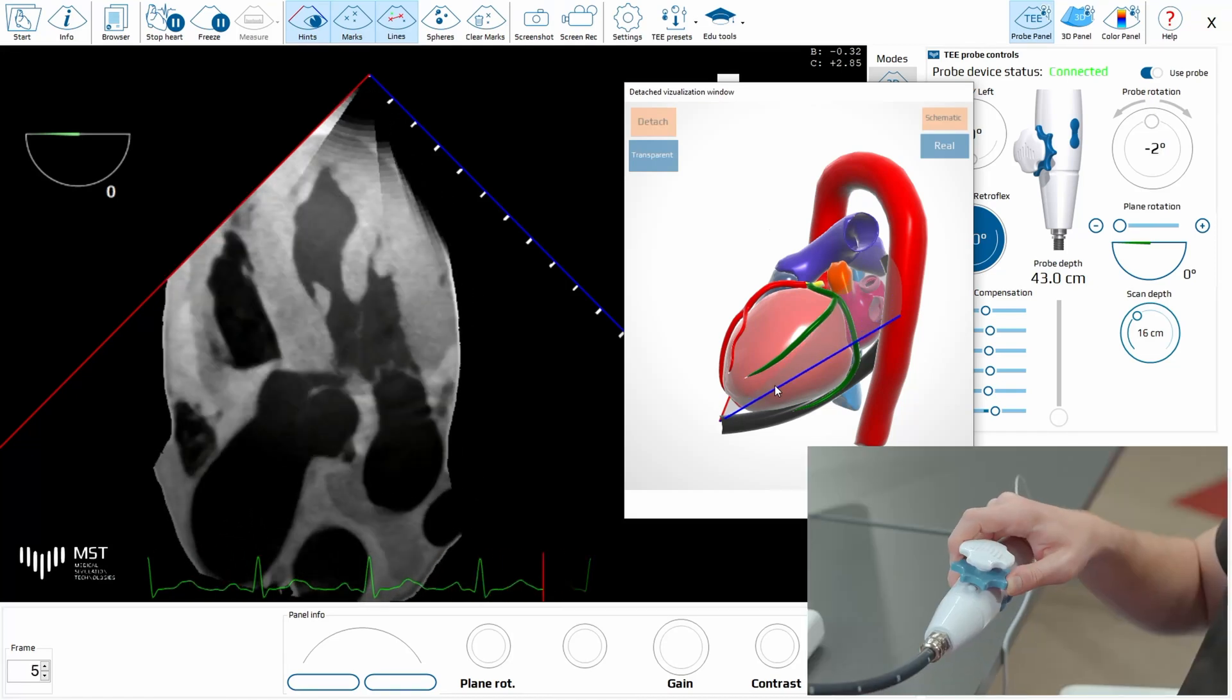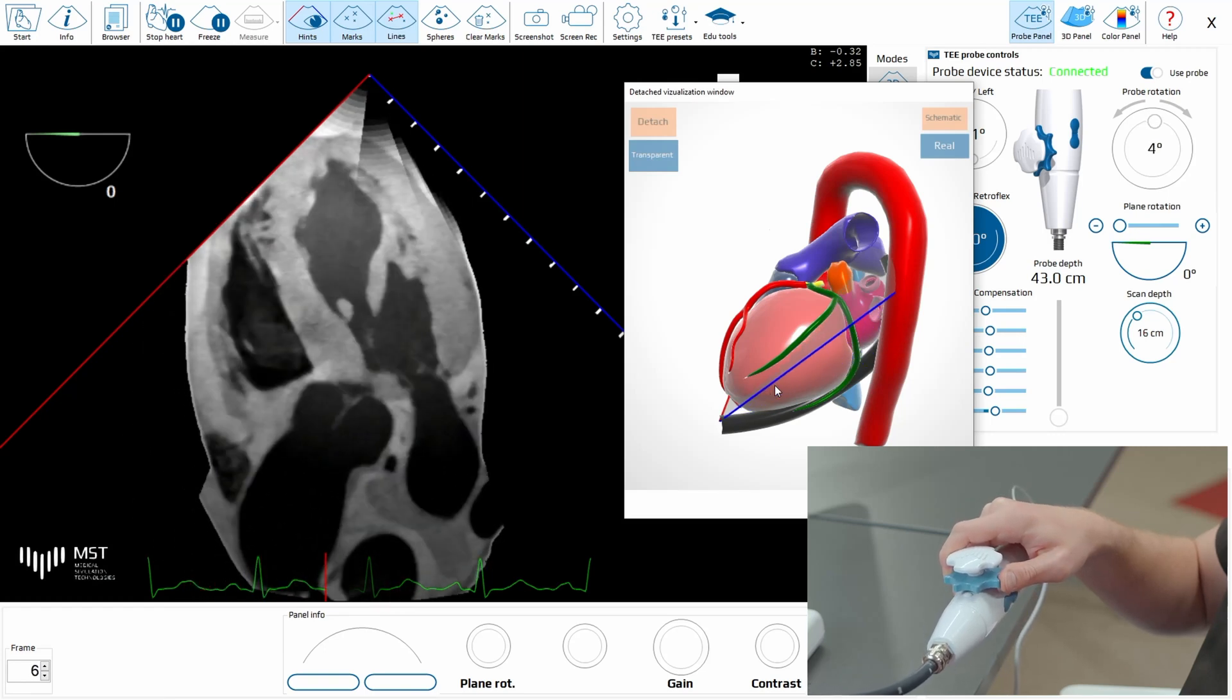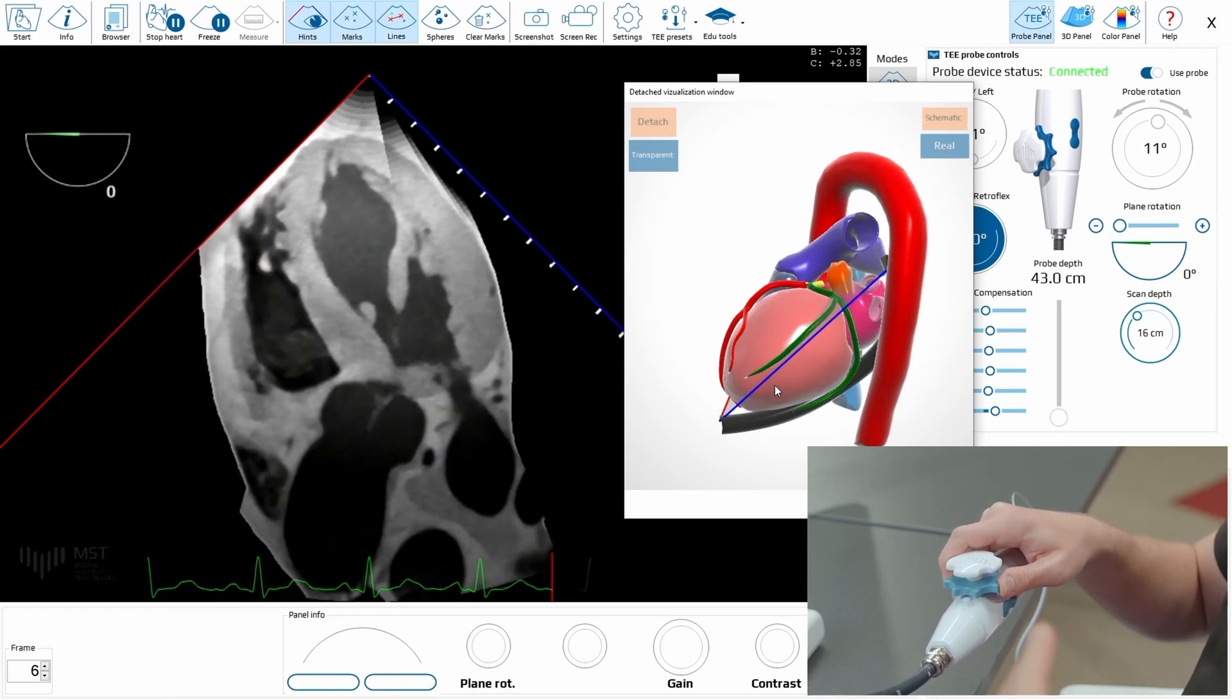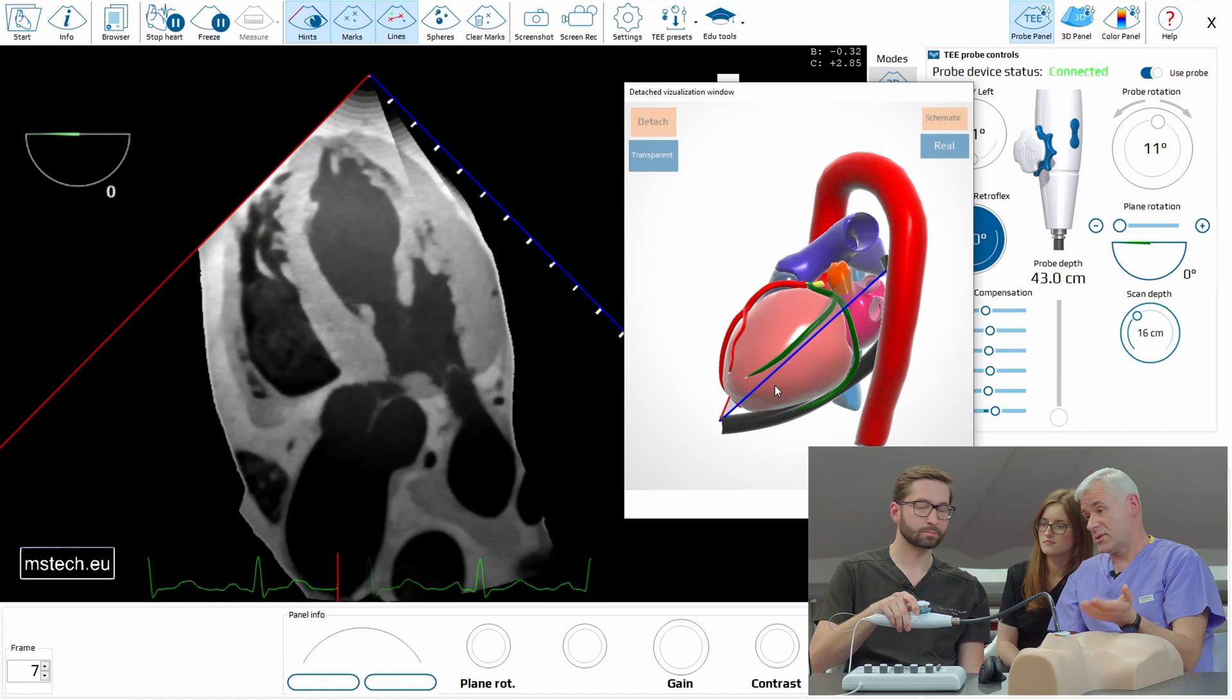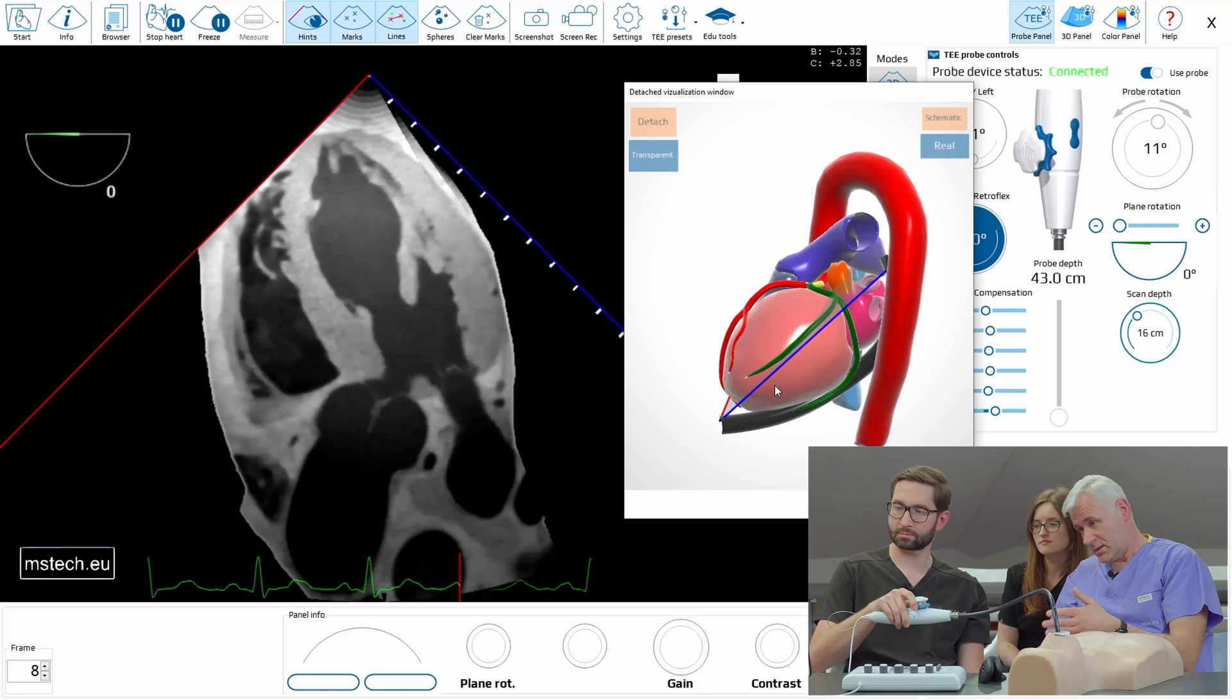So more or less you are there. Of course there are many other views. There are views on the pulmonary veins. There are views on the tricuspid valve which are not so easy for the beginner. We can do it later.